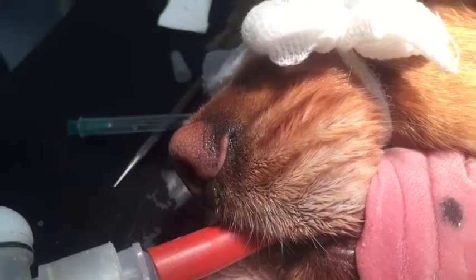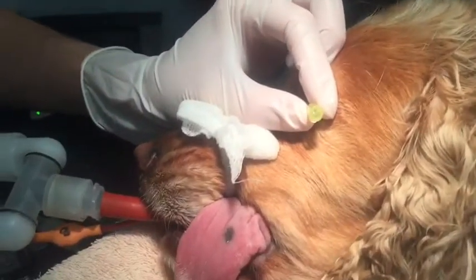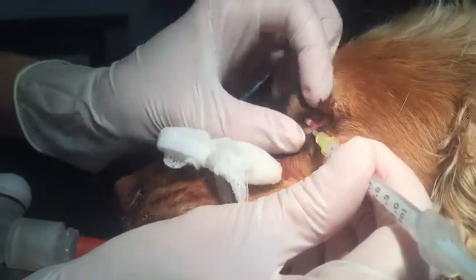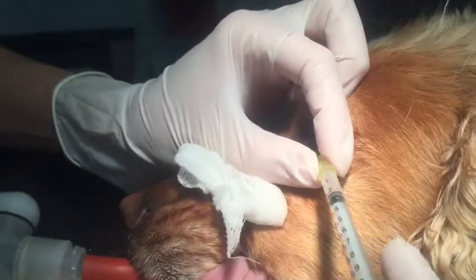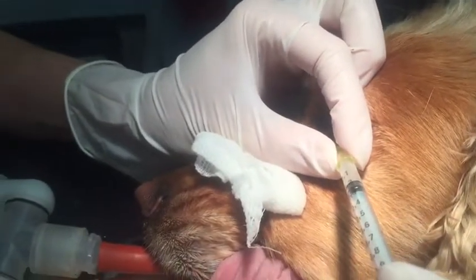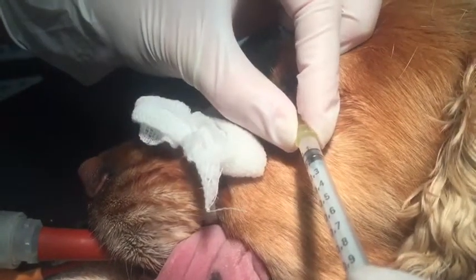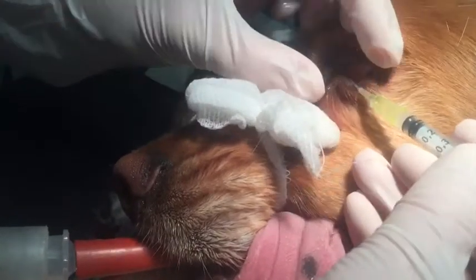And once that is done, you can start to see the liquid flowing gently out of the nostril as it has come fully down and out the nasal punctum. I've then put a little bit of maxitrol along the nasolacrimal duct to help reduce the inflammation in that area and as an antibiotic.